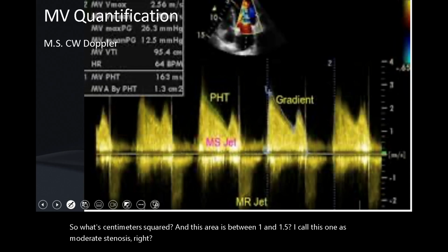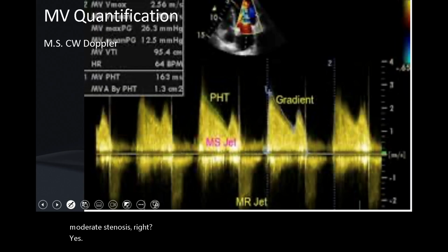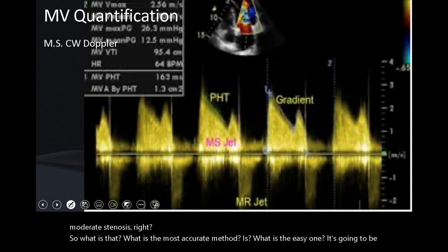Yes. So what is asked in the exam, what is the most accurate method? You see planimetry. What is the easy one? It's gonna be the pressure half time.